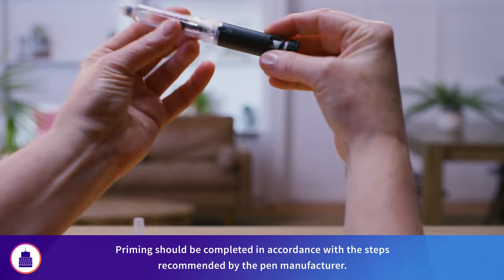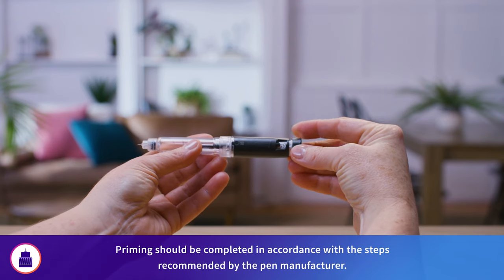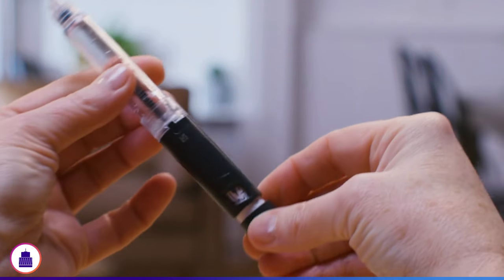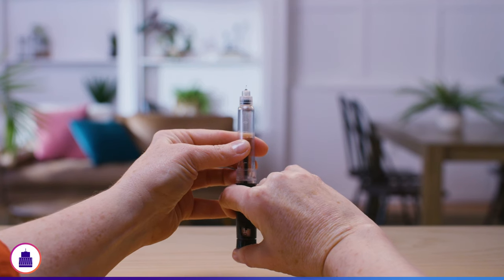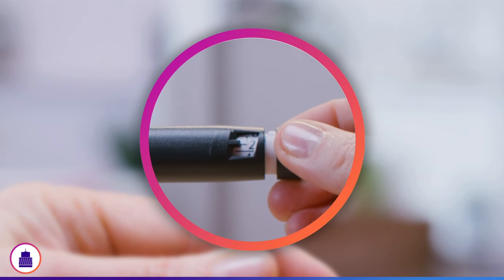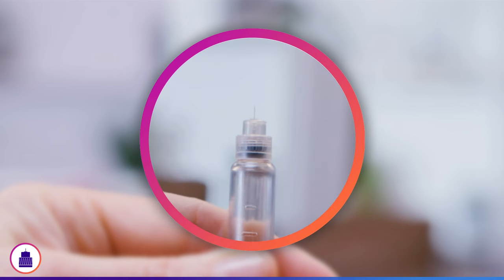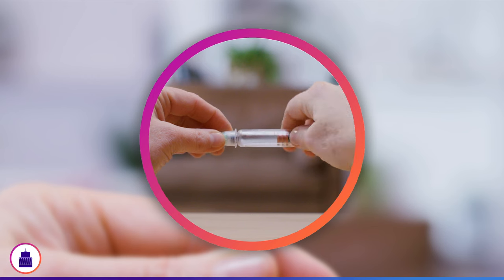Before giving an injection, you will need to prime the pen. For most insulin pens, rotate the dial on the pen until two units is displayed in the dose window. Hold the pen pointing upward and press the dose button down with your thumb to inject into the air. You should see a small drop of liquid at the needle tip. If no liquid is present, dial an additional two units and repeat the priming step. If you still do not see insulin, change the pen needle and repeat the priming step.